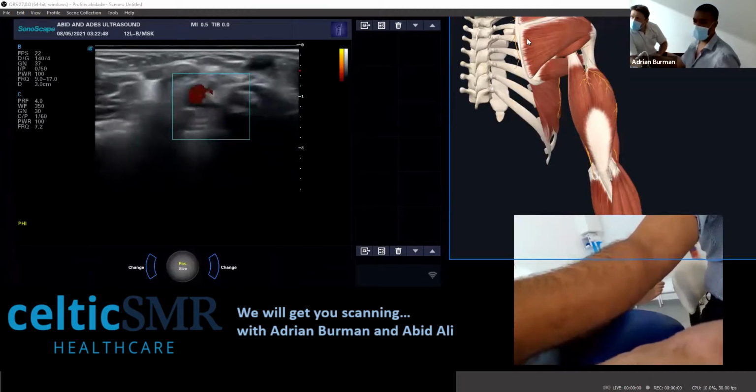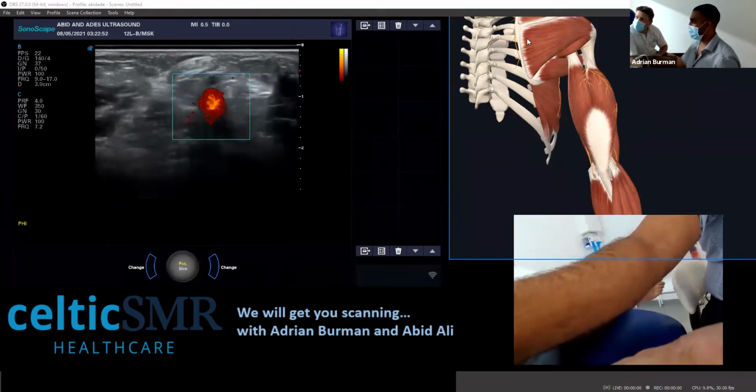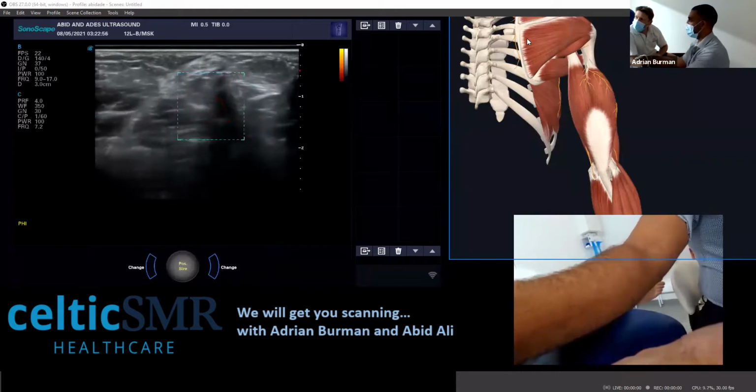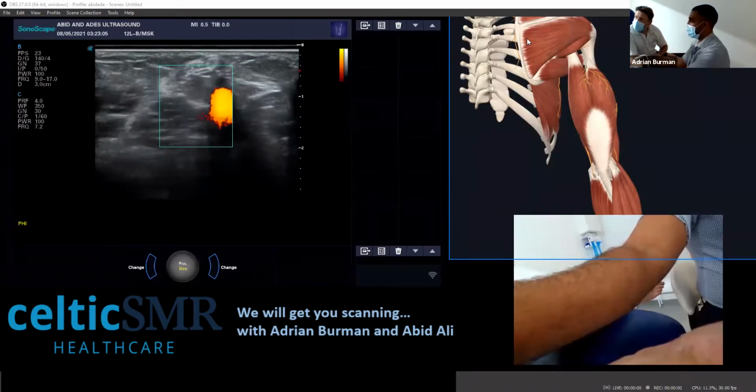And of course, just shrink that box to just about as slightly bigger than whatever it is that you're looking at. Otherwise, if it's too wide, you're just losing signal. Yeah. We're just not getting it. So you really got to adjust your little box setting to make sure.